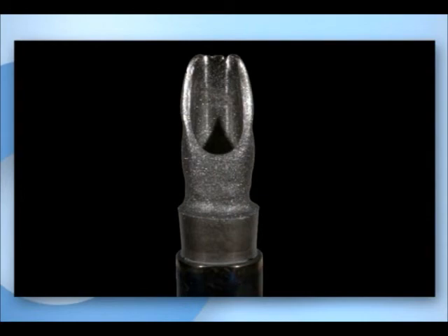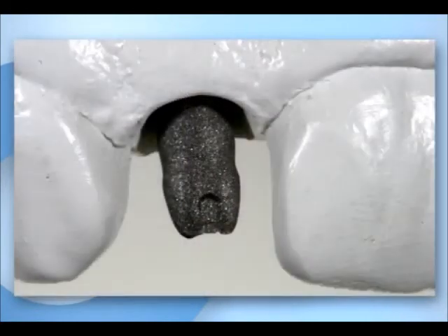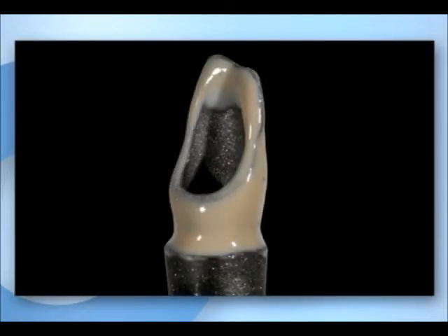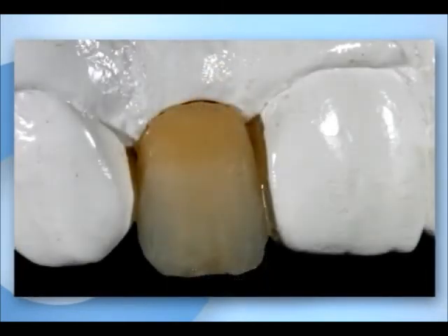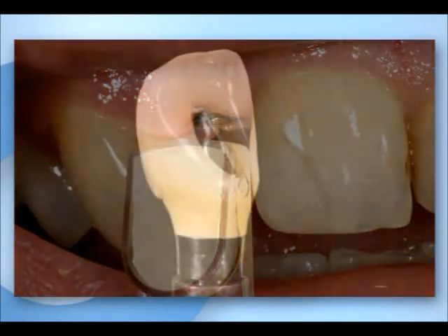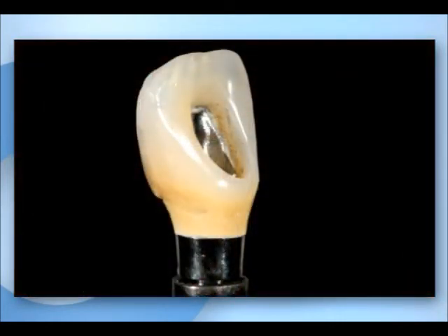A Camlog Universal Abutment is selected for this restoration. The prepared abutment is sandblasted and can be used as the base for a temporary crown. The metal surface is covered with opaquer. Veneering material is built up in layers step by step until the final shape is reached. The lab technician makes a final check of the shade to ensure the natural appearance of the crown. The implant crown is finished.